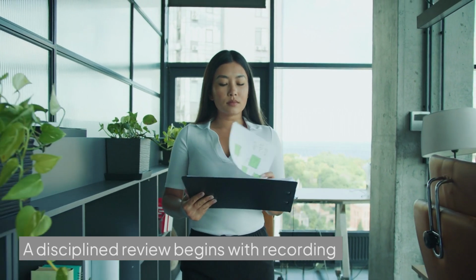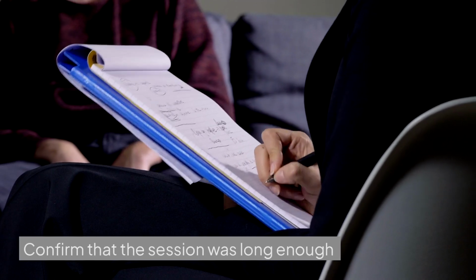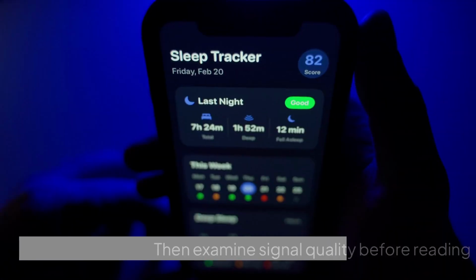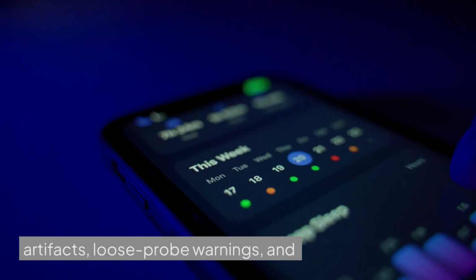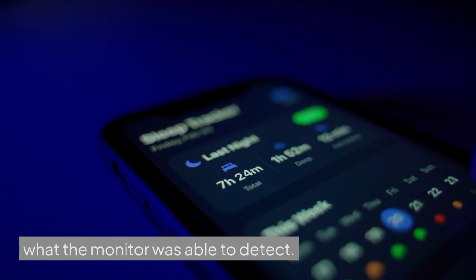A disciplined review begins with recording duration and completeness. Confirm that the session was long enough for its intended purpose and identify gaps, early removal, or interruptions. Then examine signal quality before reading the headline scores. Low perfusion periods, movement artifacts, loose probe warnings, and unreliable intervals can materially change what the monitor was able to detect.